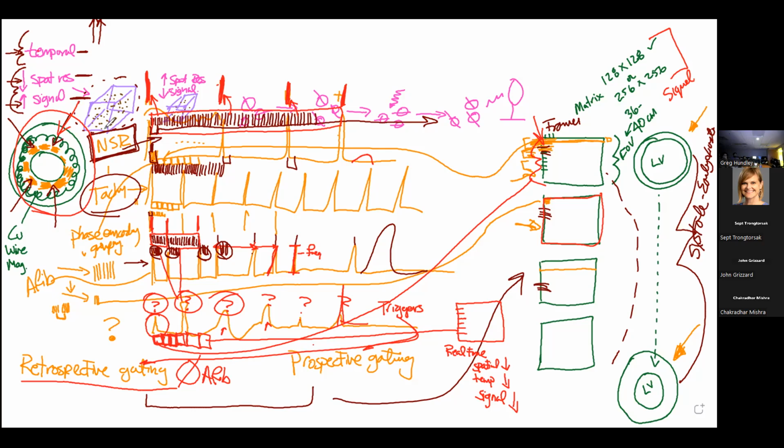So we have some reasonable sequences, but when you switch to this, make sure you have 40 to 50 millisecond temporal resolution, because that gives you enough frames in the movie to appreciate end systole and end diastole, so that you accurately calculate your ventricular volumes. Additionally, you want enough signal and spatial resolution so that you can appreciate the endocardial border.